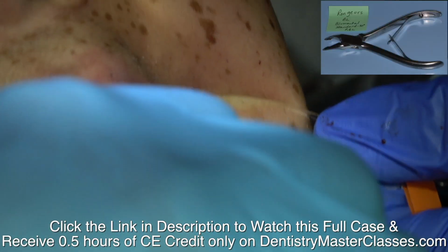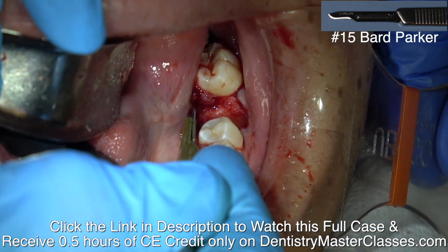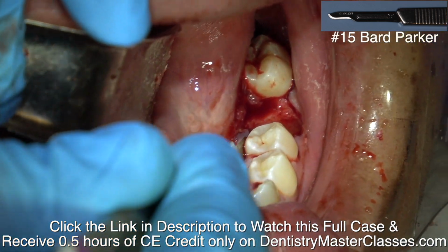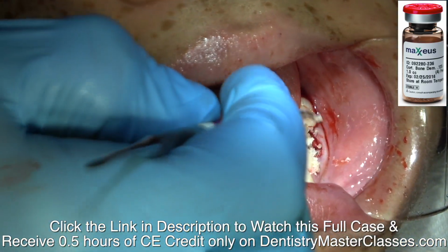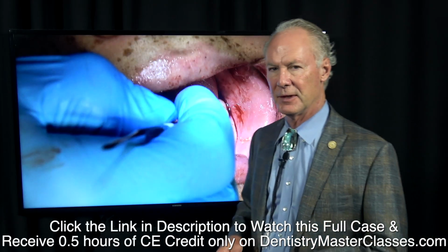There's the piece. Be sure you protect the airway. You don't want the patient to aspirate the piece of the tooth. Also, if there's amalgam fillings or things like that. Now let's talk about grafting the socket.